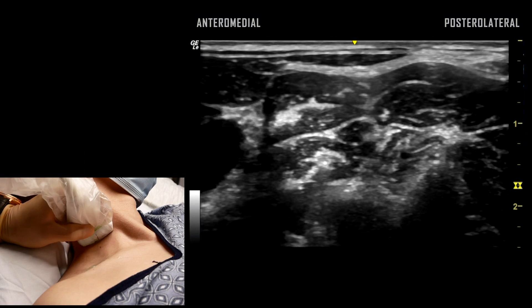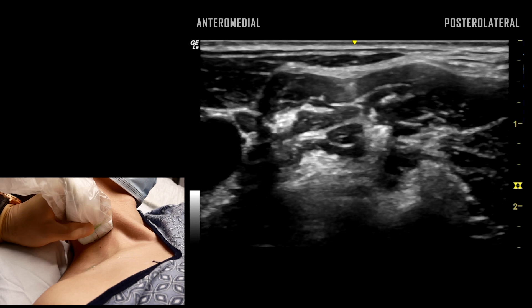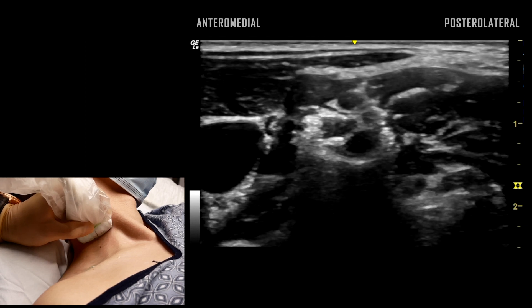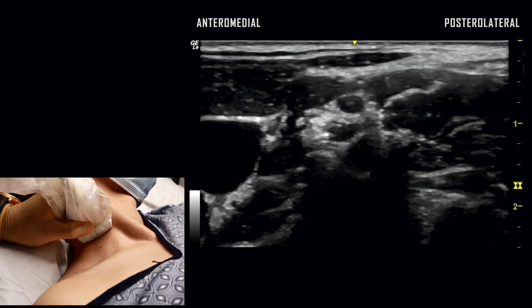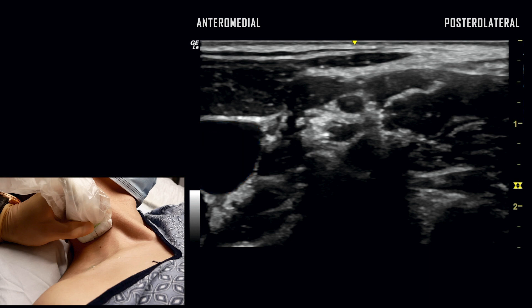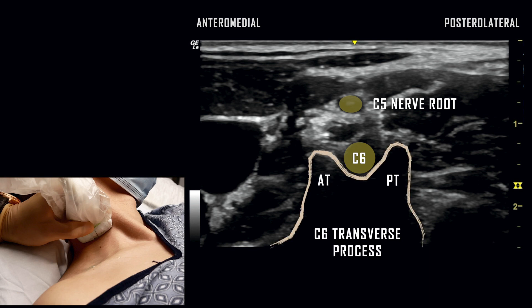With continued cephalad translation of the ultrasound probe, the internal jugular vein is now identified more prominently. The split C6 nerve root has also coalesced and is visualized as a hypoechoic structure held between the anterior and posterior tubercles of the C6 vertebra.